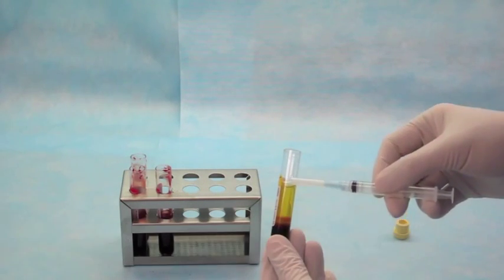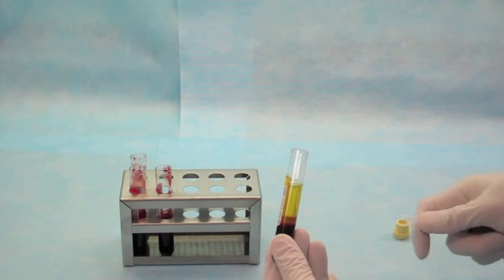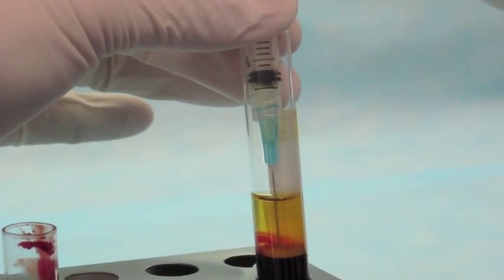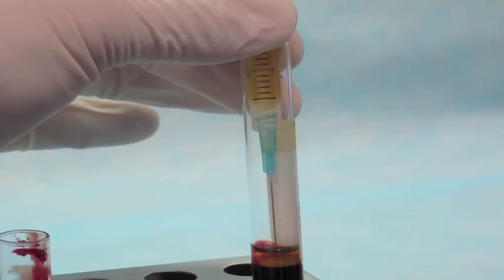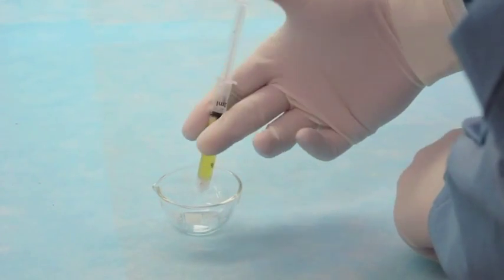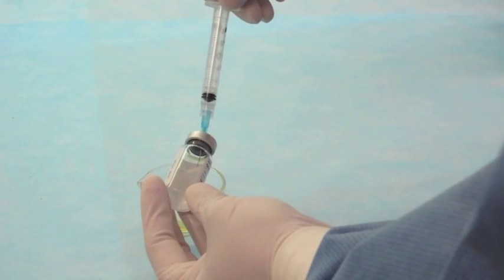We can also use the platelet concentrate contained in the yellow top tubes that had the anticoagulant, so a clot will not form within the platelet concentrate. We're interested primarily in the layer closest to the red blood cells, which contains the vast majority of the growth factors. Take a syringe and draw off the upper layer — roughly two to two and a half cc's of fluid from a 10 milliliter tube — leaving you with roughly two to two and a half cc's that has a greater concentration of growth factors for use in the surgical procedure. Many surgeons prefer to form a clot with that growth factor, which can be accomplished by incorporating calcium chloride into the plasma.